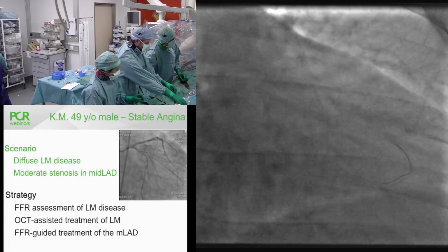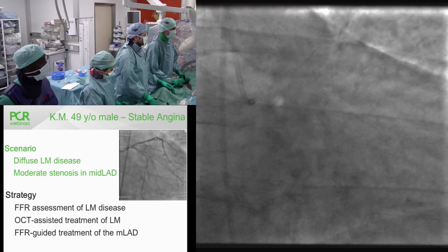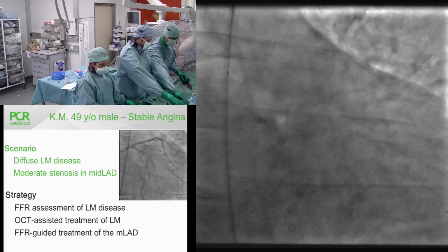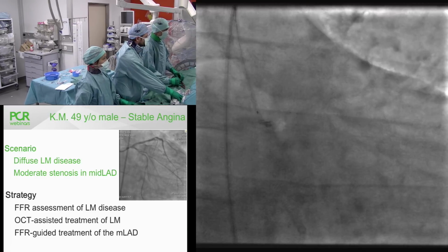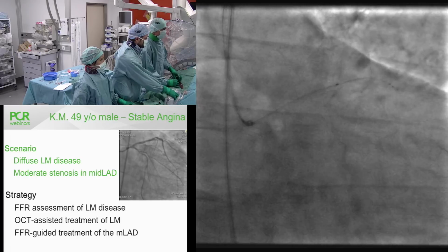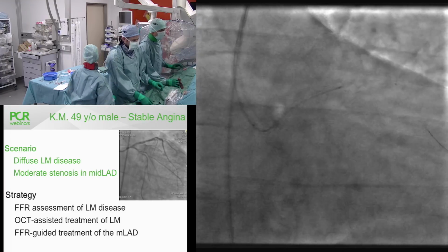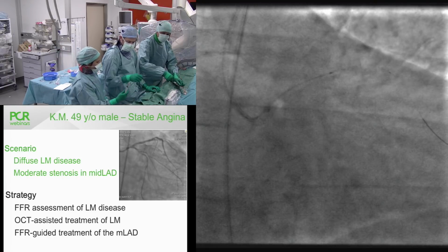Well, you know, Emanuele, what I want to know in this left main is the size, period. A little bit, of course, whether there is calcification, but I think this is not a very calcified left main. I would like also to see the ostium of the circumflex and the size of the LAD. But what I would like to have is an idea of the diameter of the left main. So whether we see the ostium is not that important. I will even engage the guiding quite well, and you can monitor that on the basis of the pressure. We need the big syringe.